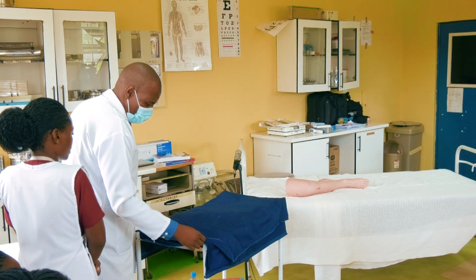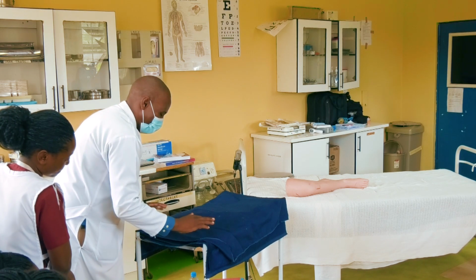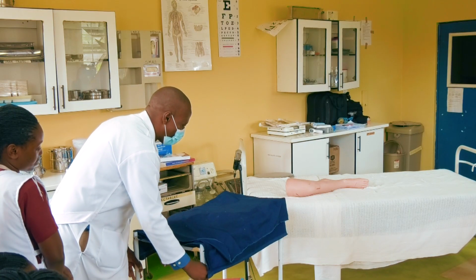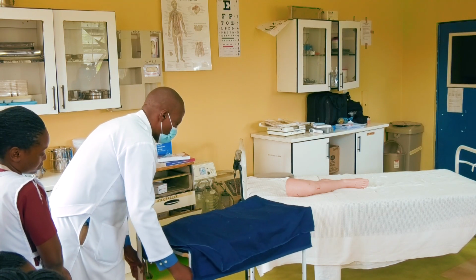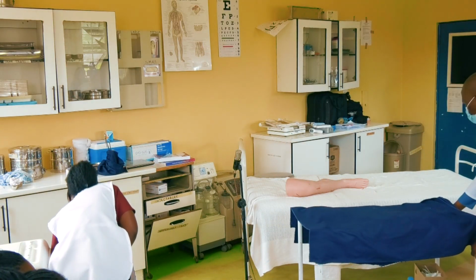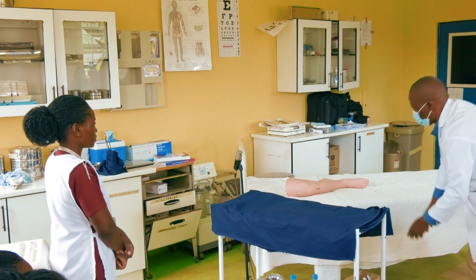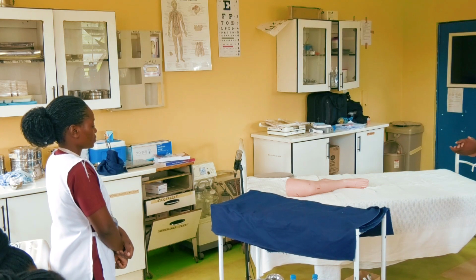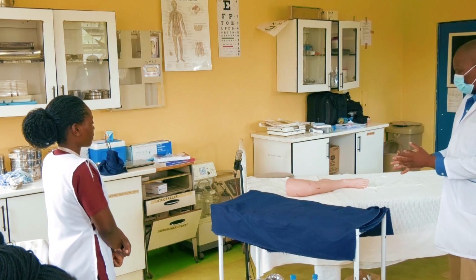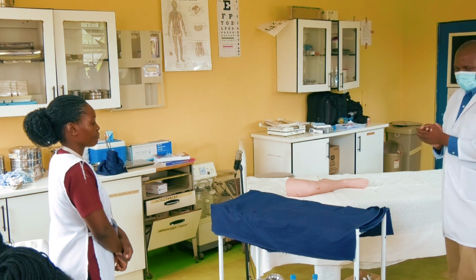So when you are moving with your trolley, you hold here, right? Not up here. Pastor Bruce has told us we are using that term, it's a hold, right? So you wheel your trolley. This is the right side of the patient. It's supposed to be that. Okay, so you talked to the patient already and everything is done. So what do we do now? Since this is covered, I'm by the bedside. What I need to do is go and scrub.